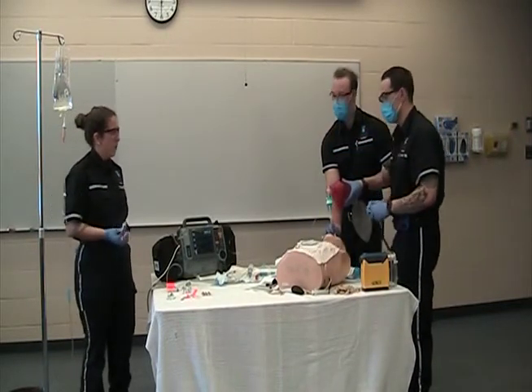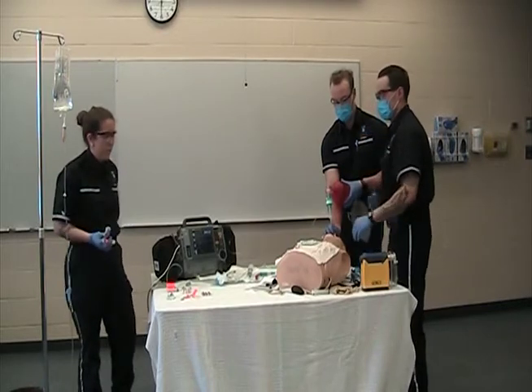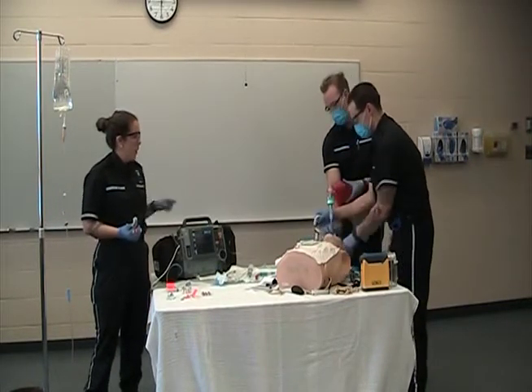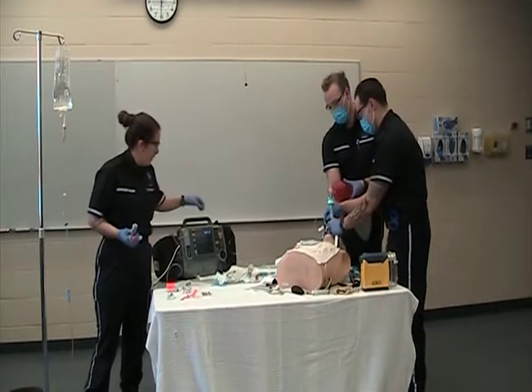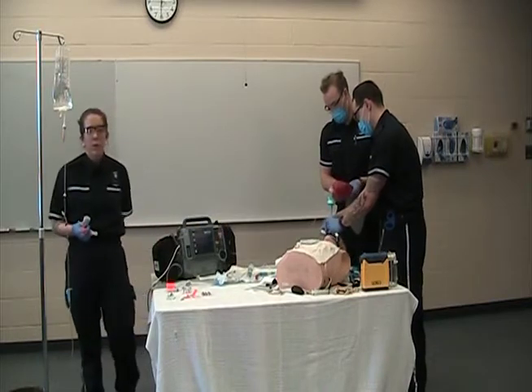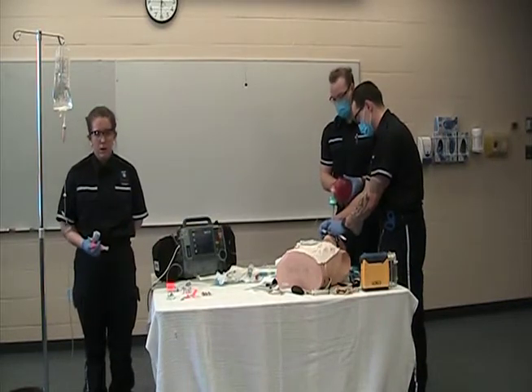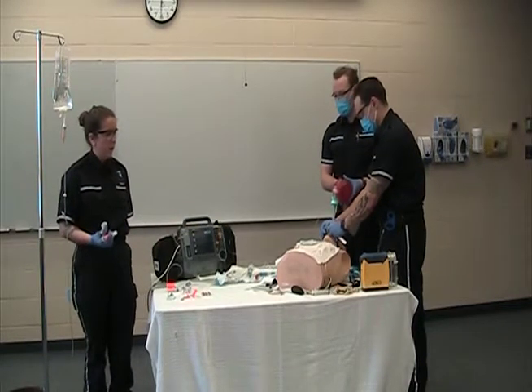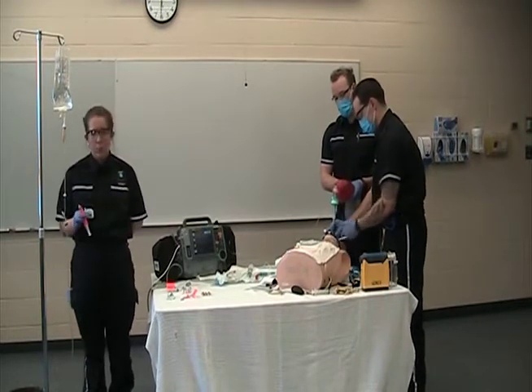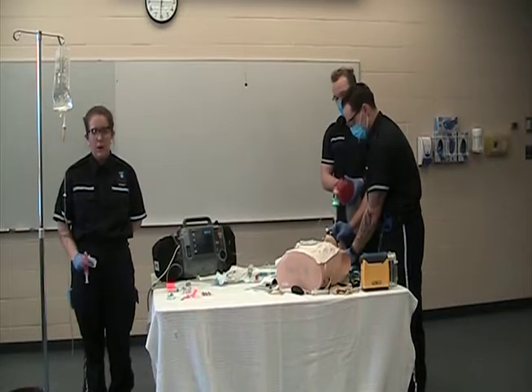Perfect. So do we have our 6 confirmations? Yeah, lungs are clear bilaterally and no epigastric sounds. Perfect. So after our 6 confirmations, we're going to use our Thomas tube holder, and as well we're going to get a full set of vital signs prior to administering our maintenance of paralysis and sedation. Once I get my vital signs back, as long as they check out okay, I'm going to be pushing 1 milligram per kilogram of ketamine to maintain sedation.